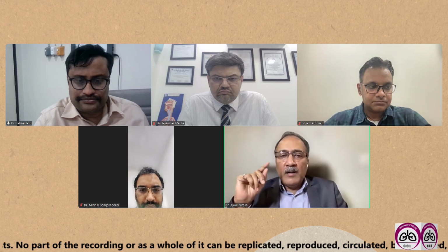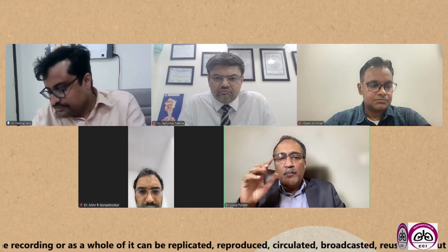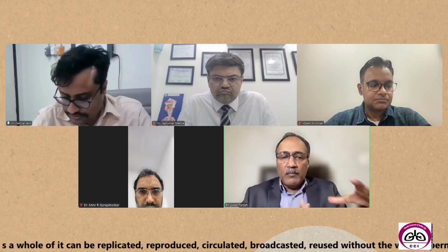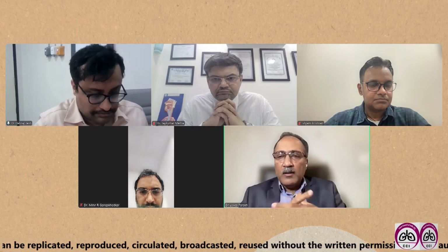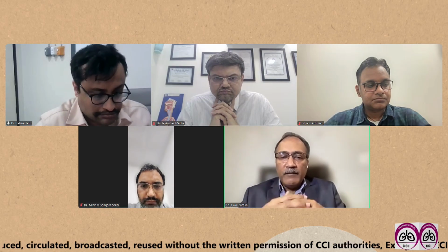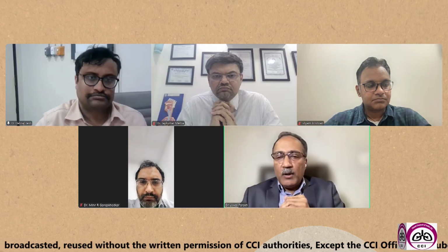Can I comment? Right. So the advantage with Olympus is it comes with a complete ecosystem. It comes with its own processor, its own ultrasound machine, its own needles. So it's a complete ecosystem, while others will always have more compatible things available to them so that you can use them. So that's the advantage with Olympus.